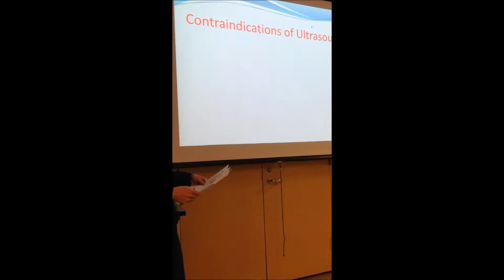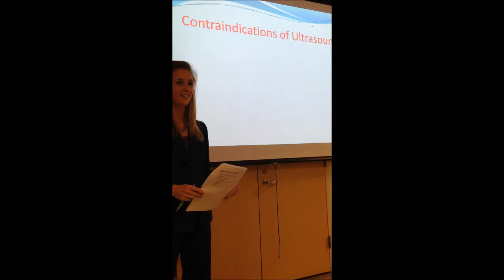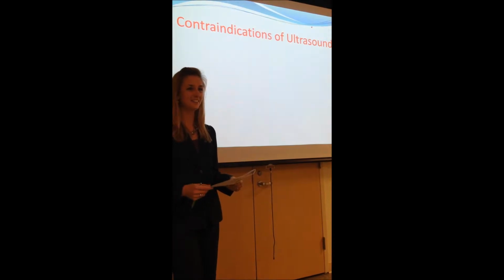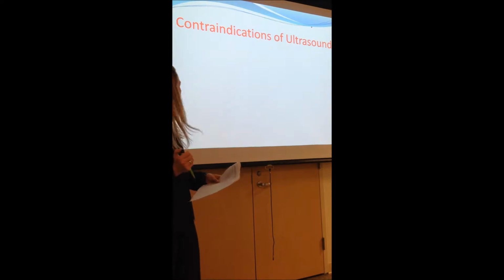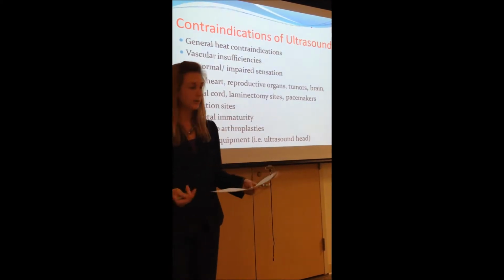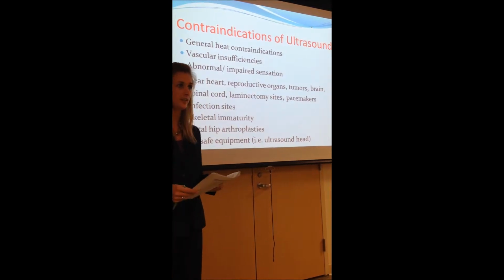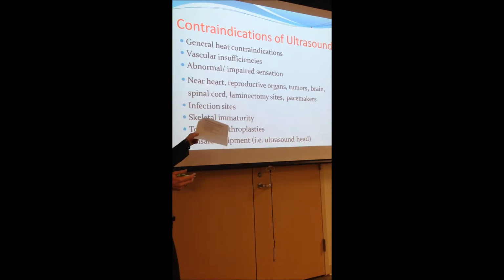Now, contraindications. Can we have a few of those shouted out? Tumors. Near the heart. Yes. Any others? Shout them out, don't be shy. Infection sites. Oh yes, perfect, those are great. So, our general heat contraindications, we're aware of those. Also, any sort of vascular insufficiency or impaired sensation, not a good idea to do ultrasound in that area. Again, near the heart or any of these other areas.